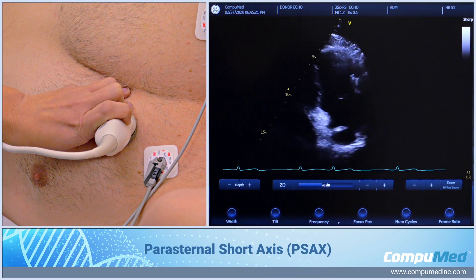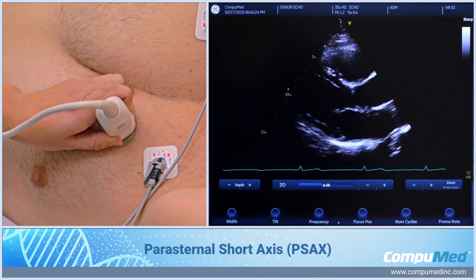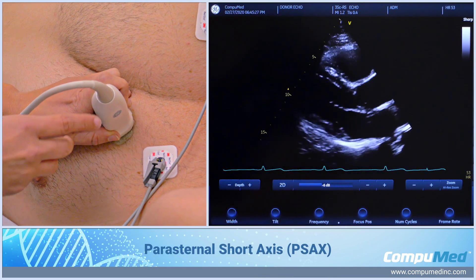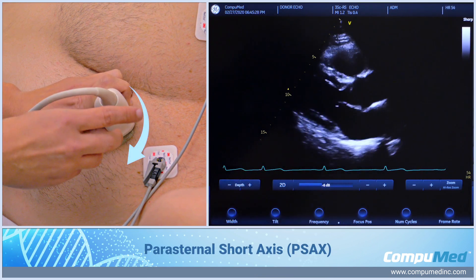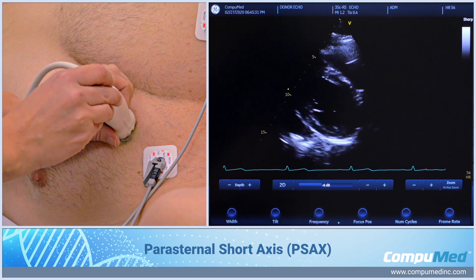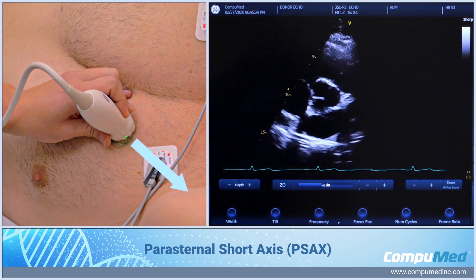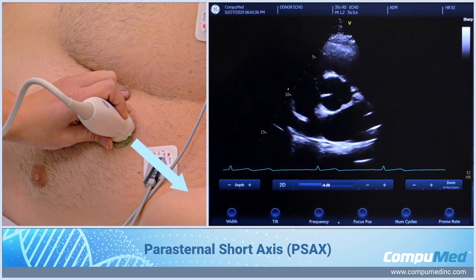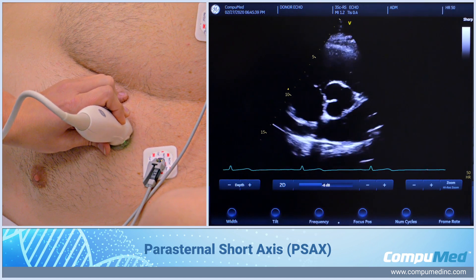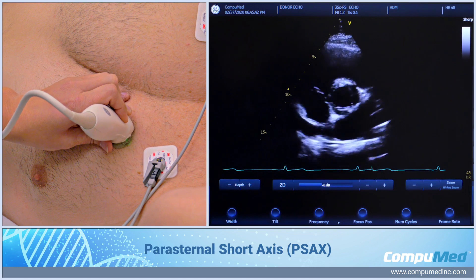To move on to parasternal short axis, I'm going to go back to home base of my parasternal long axis and rotate my transducer clockwise in the same position to about 2 o'clock. My index marker is now pointing towards the patient's left shoulder, and I'm just angling anterior towards his head slightly to bring that in.